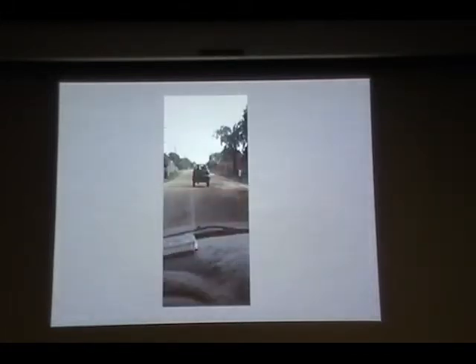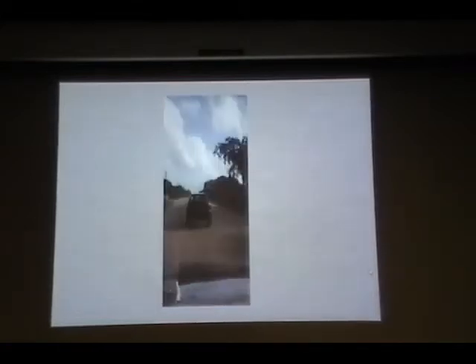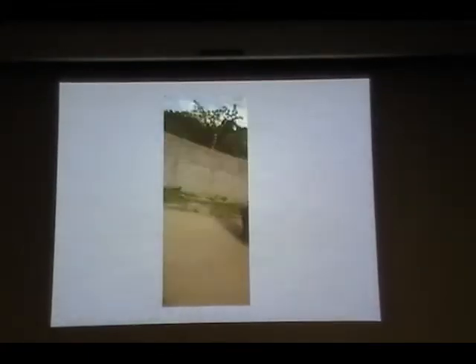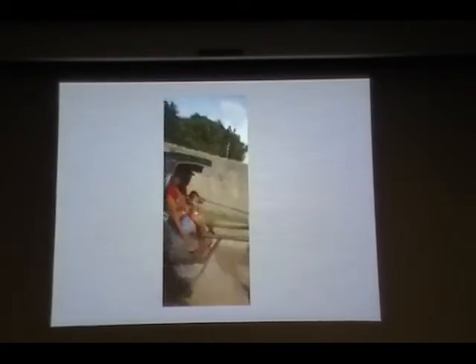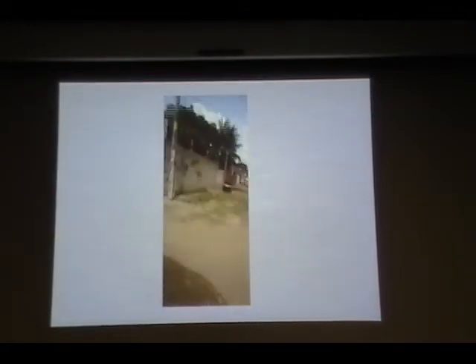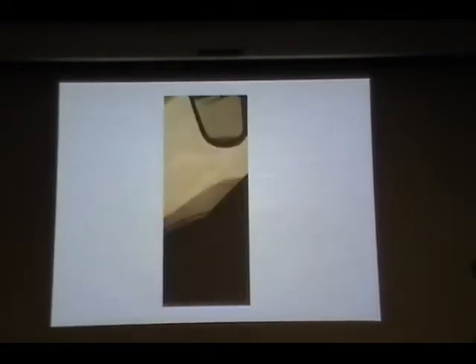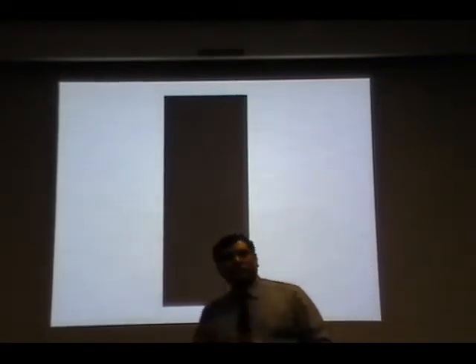And I'm not sure I shared this video with you guys, but let's see if it's going to work. So, a nice, beautiful car from behind. That's exactly what is going to happen. If you're taking an image from behind and projecting, there is a chance that it could be diagnostically challenging or completely obscure information that is not helpful for us.